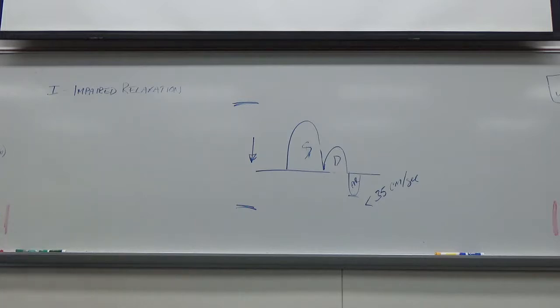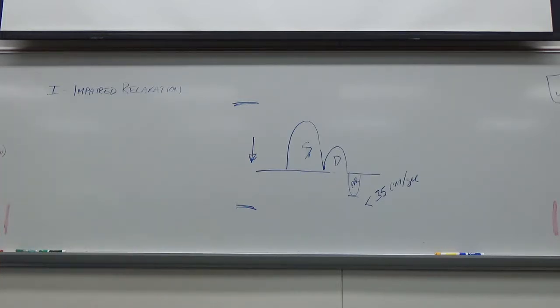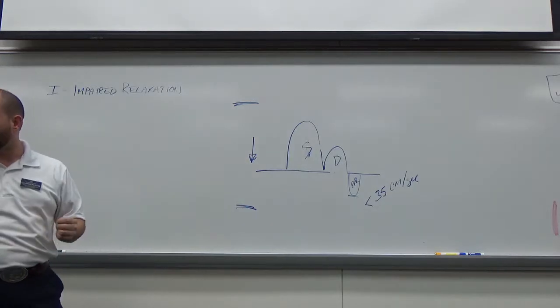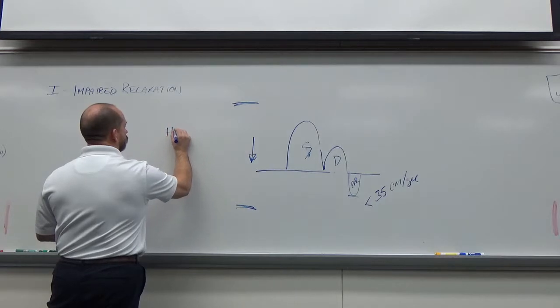Do you guys remember what your velocities were measured the other day-ish? It's probably going to be around 40 to 60 centimeters per second. The biggest problem on this, just to give you a heads up for lab, is high PRF. You guys have talked about high PRF, I think, in physics, right? So it's HPRF.